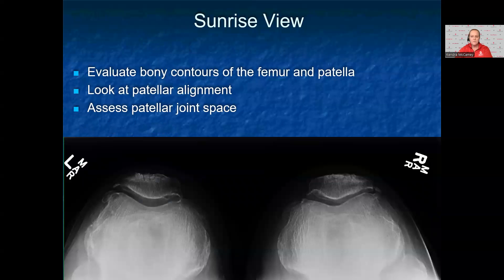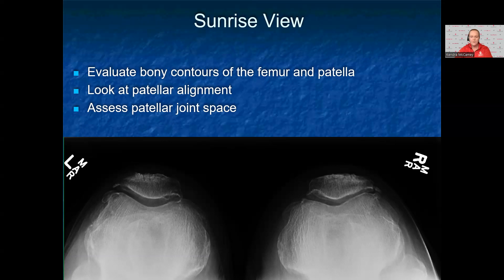The sunrise view looks at the patellofemoral joint at a different angle than the lateral view. First, assess for alignment of the patella in relation to the femoral condyles. Evaluate the bony contours of both the patella and the femur, starting with the bony cortex, followed by the interior of the bone. Next, look at the patellofemoral joint space. In this x-ray, the patient has normal patellar alignment with mild lateral patellofemoral joint space narrowing on the right knee and osteophytes present on bilateral patella.